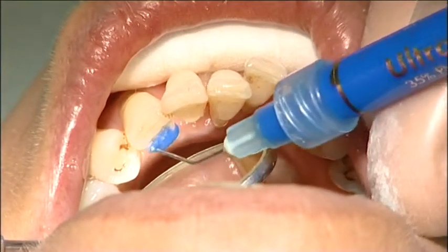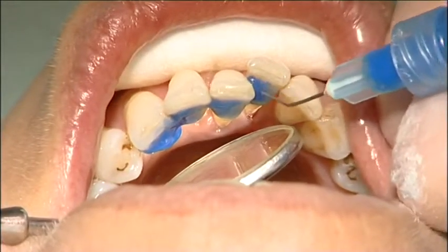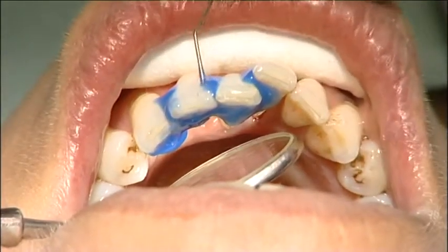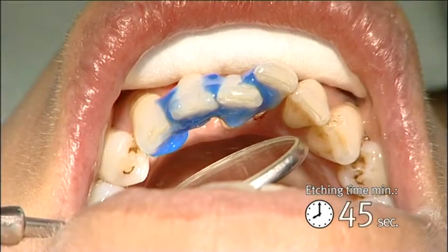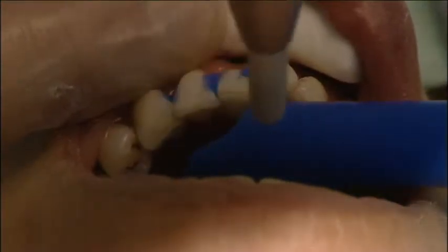The bonding surfaces of the teeth were etched with orthophosphoric acid for 45 seconds. The interproximal area should be etched too, and the etching time should be long enough for proper bonding. Tooth surfaces were then rinsed and dried.